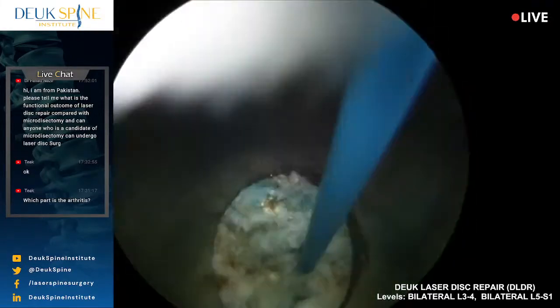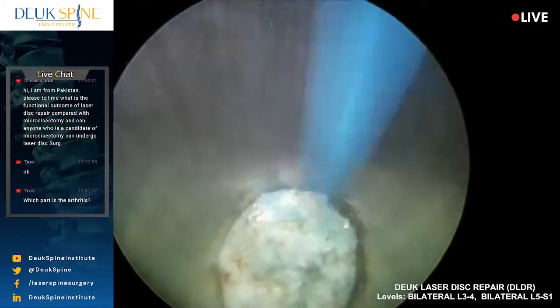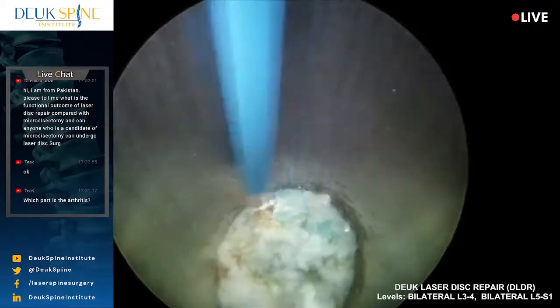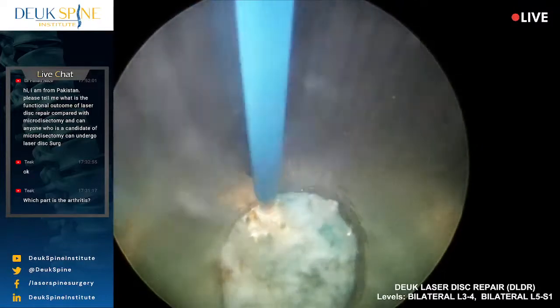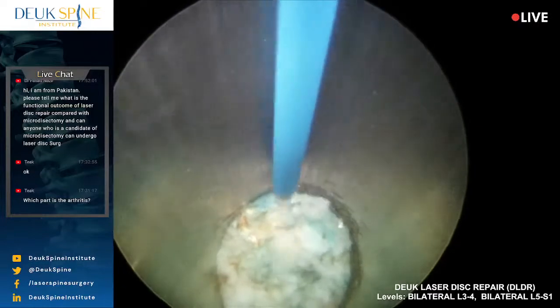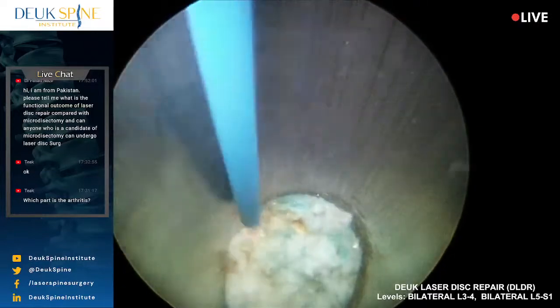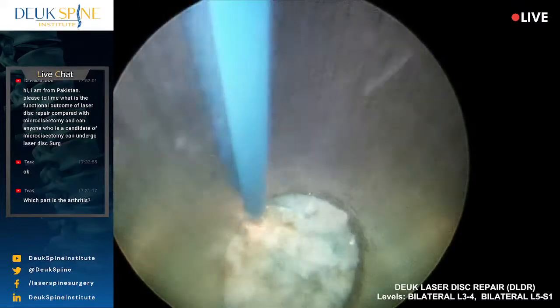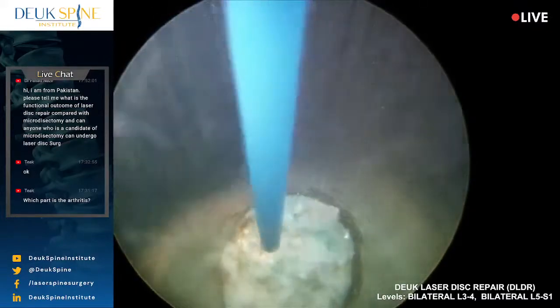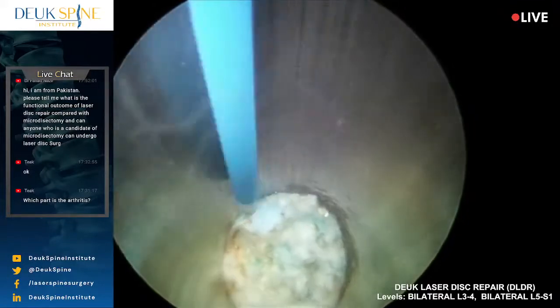Yeah, they're both bad. So we have a hockey player who is asking, I've got a bad disc in my neck and I need something done. The best surgery is what you're watching, the laser surgery. I'm going to start out by just saying that. The ACDF is going to give you a nice strong repair, but it's going to cause the other disc to wear out faster.